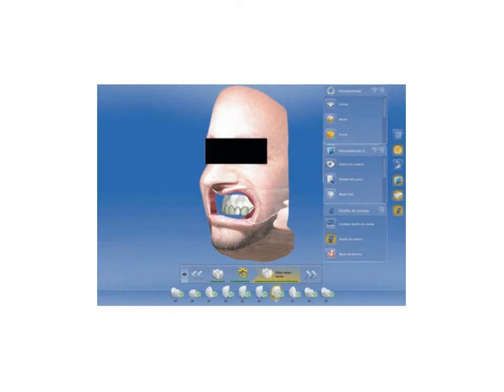Two-dimensional analysis of smile is gradually being replaced by three-dimensional smile analysis, which could perform digital simulation by incorporating depth as a third dimension. Moreover, integration of the 3D images of the face and the smile of the patient with the planned restorations enables more predictable facially guided digital smile design and simulations.